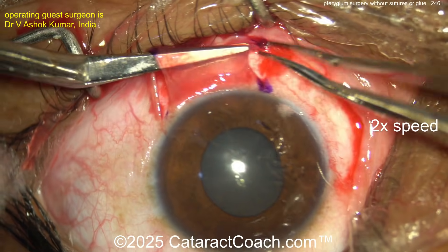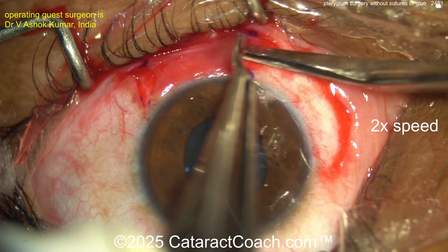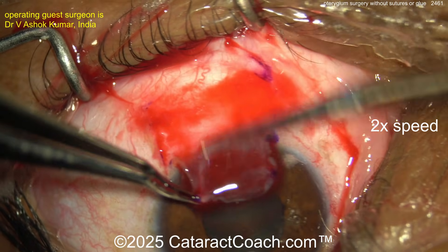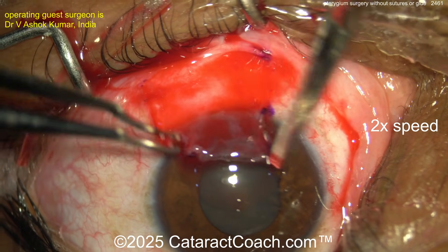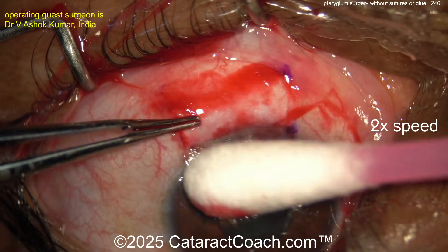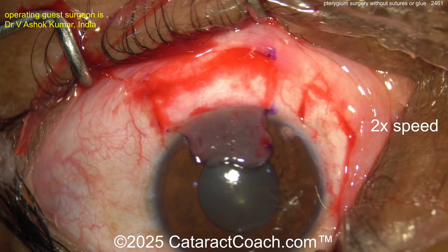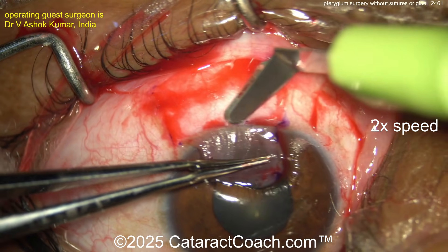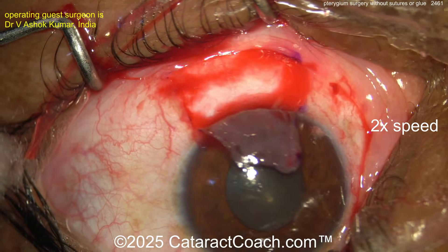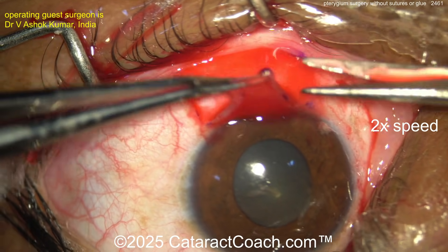Once fully dissected — I like the technique of making the two incisions first — now cutting across with the Westcott scissors to free the graft. Once you've got the right size, cutting across. Now flip it onto the cornea — remember which side is up, don't put the conjunctival graft upside down. It's upside down on the cornea for now, that's okay. Gently cutting the graft free, keeping correct orientation.